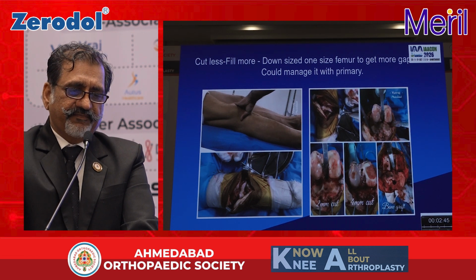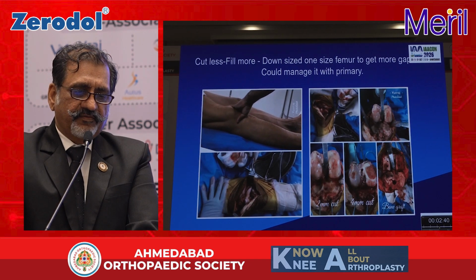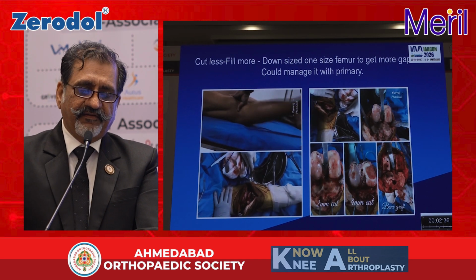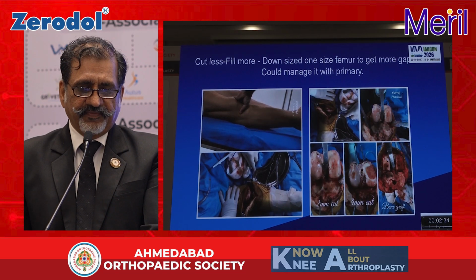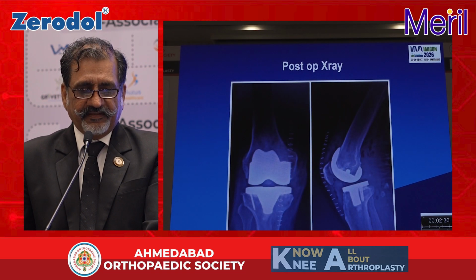So same principle: cut less, fill more. We have to check minimal bony cuts, and the remaining defect we filled with bone graft and screws, and we ended up with a primary total knee replacement.